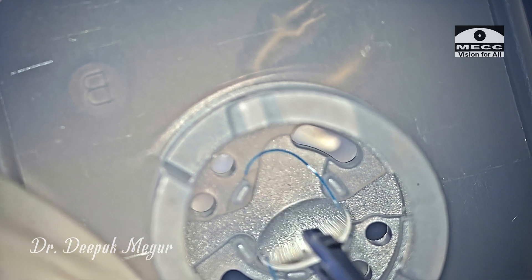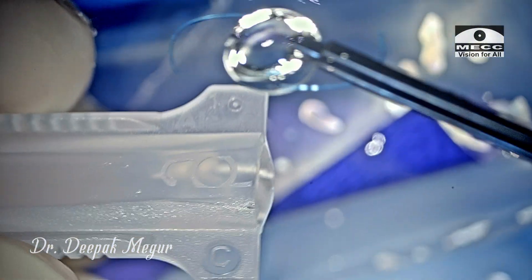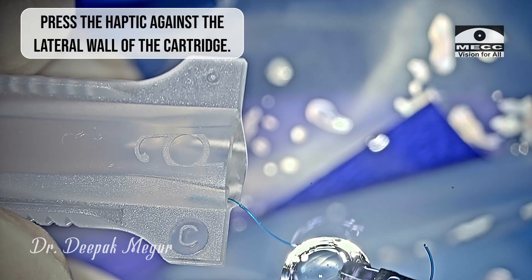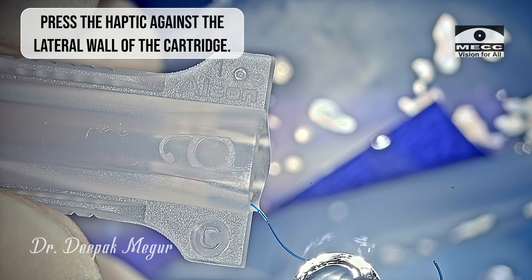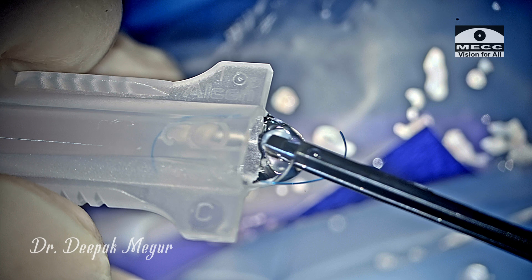Before placing the lens into the cartridge — since we are using a C cartridge which is slightly narrower than the recommended B cartridge — to prevent kinking of the haptics, I press the leading haptic against the lateral wall of the cartridge just to straighten it a bit. This ensures that it doesn't get bent and there's a lesser chance of it getting kinked.